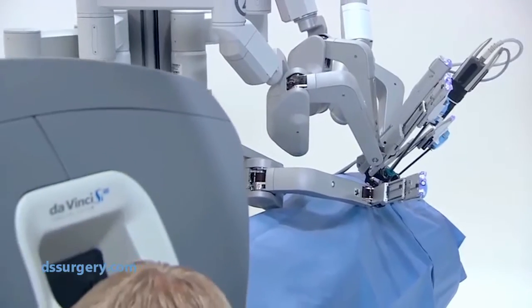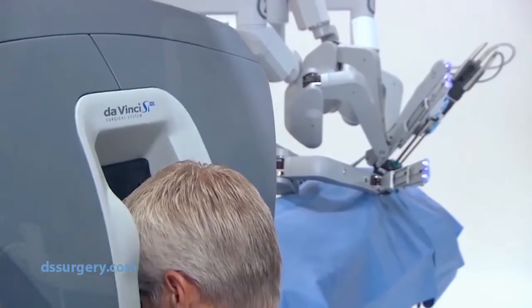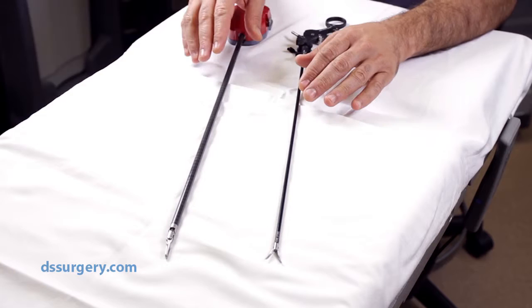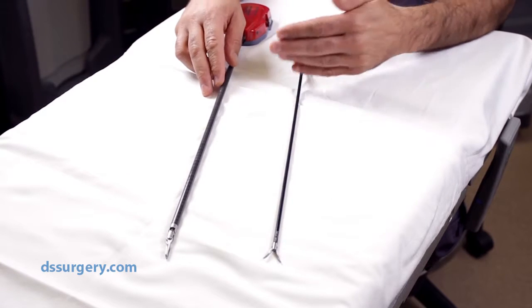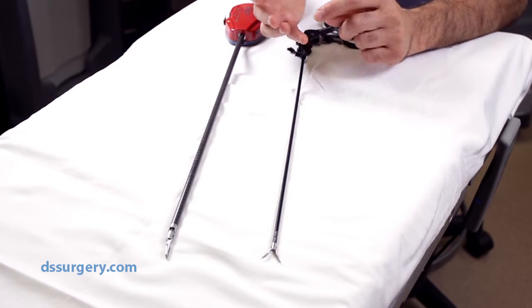What I'd like to do now is show an example of the biggest difference between a laparoscopic instrument and a robotic instrument. As I mentioned, the biggest difference in instrumentation between laparoscopic and robotic is the way the tip of the instrument rotates.